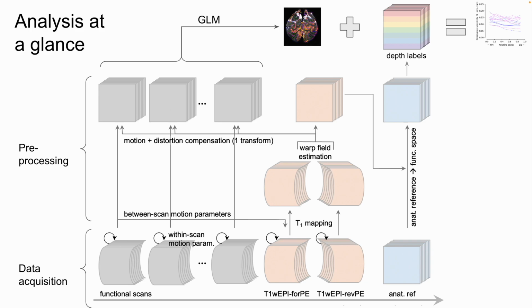Just stay in your distorted space. You know you're distorted. Don't try to correct it. Live with it. Work there. So I should add that to my list. It's on my list of weaknesses.